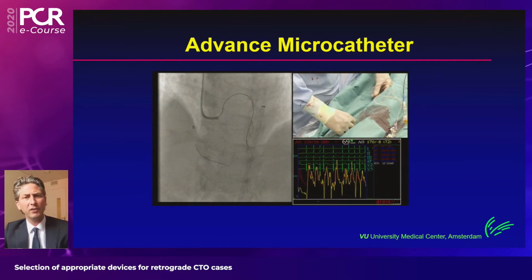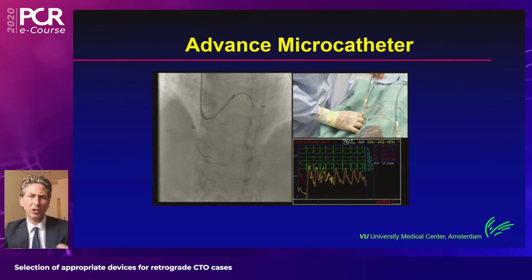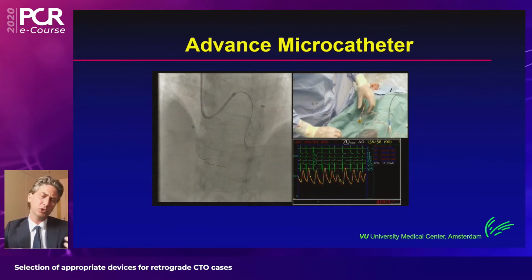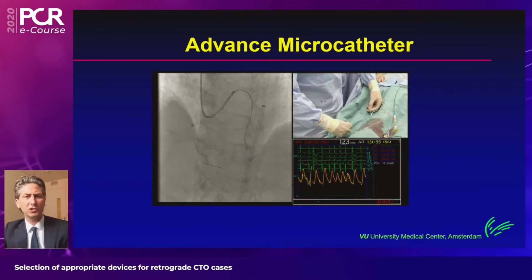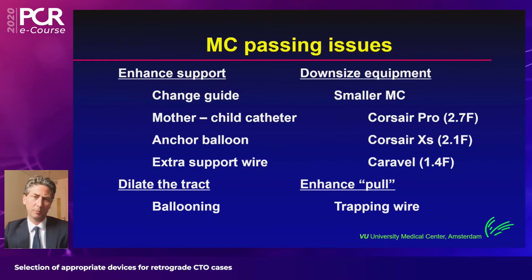Also, please note on the live image that the guide is being pushed back. So it's an interplay between pushing enough, rotating enough, but not pushing too hard so that you'll push out the guide. The second operator can help in this case by fixing the guide, so you'll have more push. But generally, this is a strategy that takes a little bit of time to maneuver yourself through the septum.